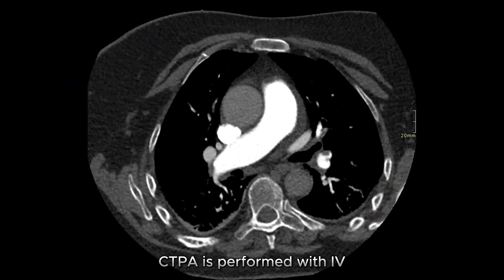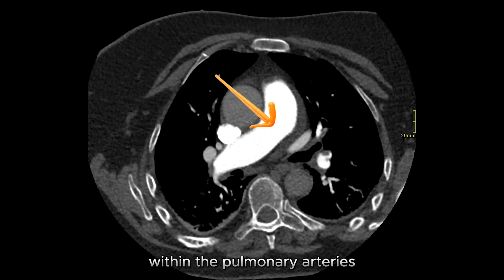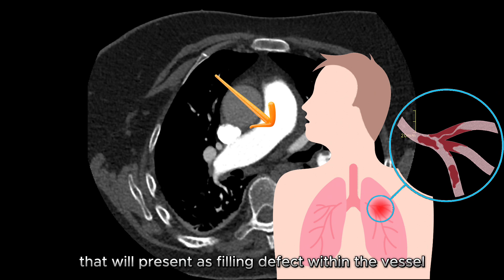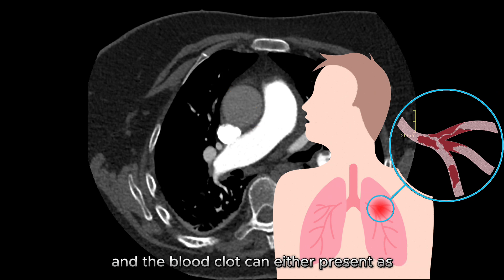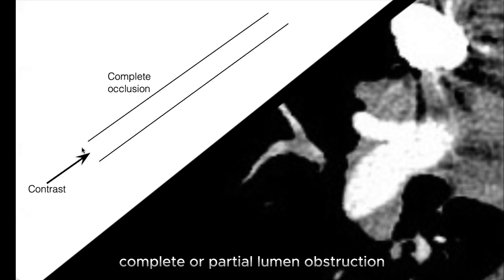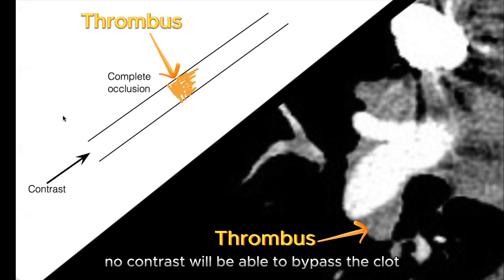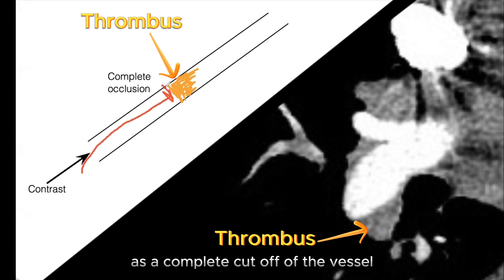CTPA is performed with IV contrast media for opacification within the pulmonary arteries. This allows direct visualization of blood clots that will present as filling defects within the vessel. The blood clot can either present as complete or partial lumen obstruction. With complete lumen obstruction, no contrast will be able to bypass the clot, and this will appear as a complete cutoff of the vessel.